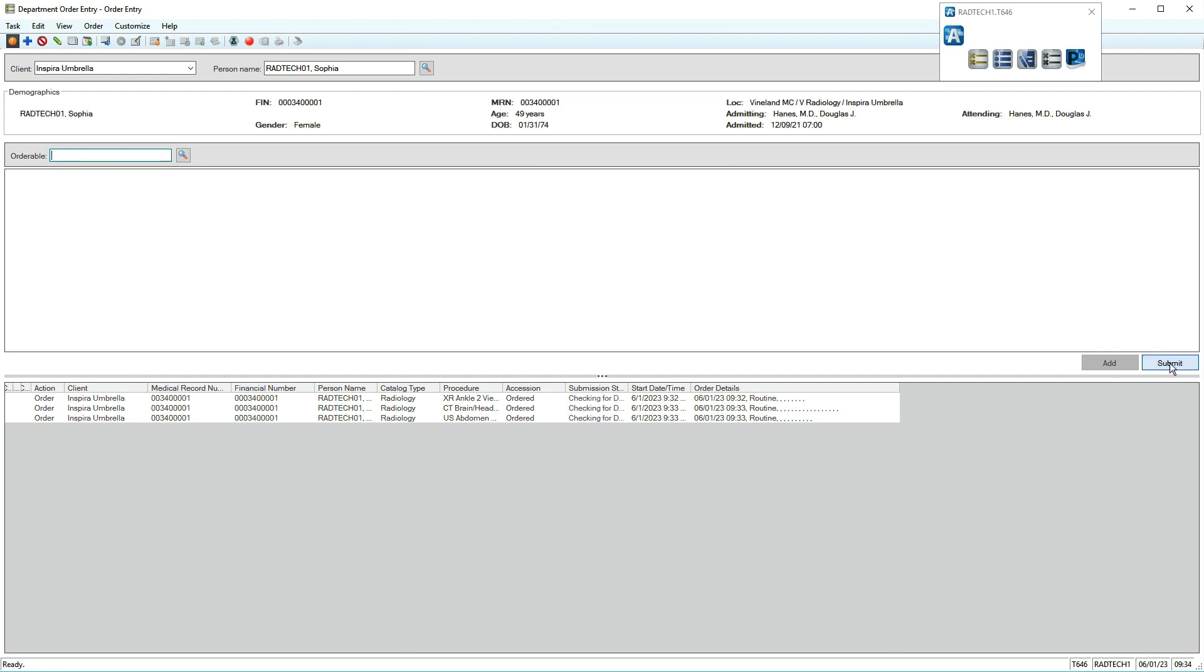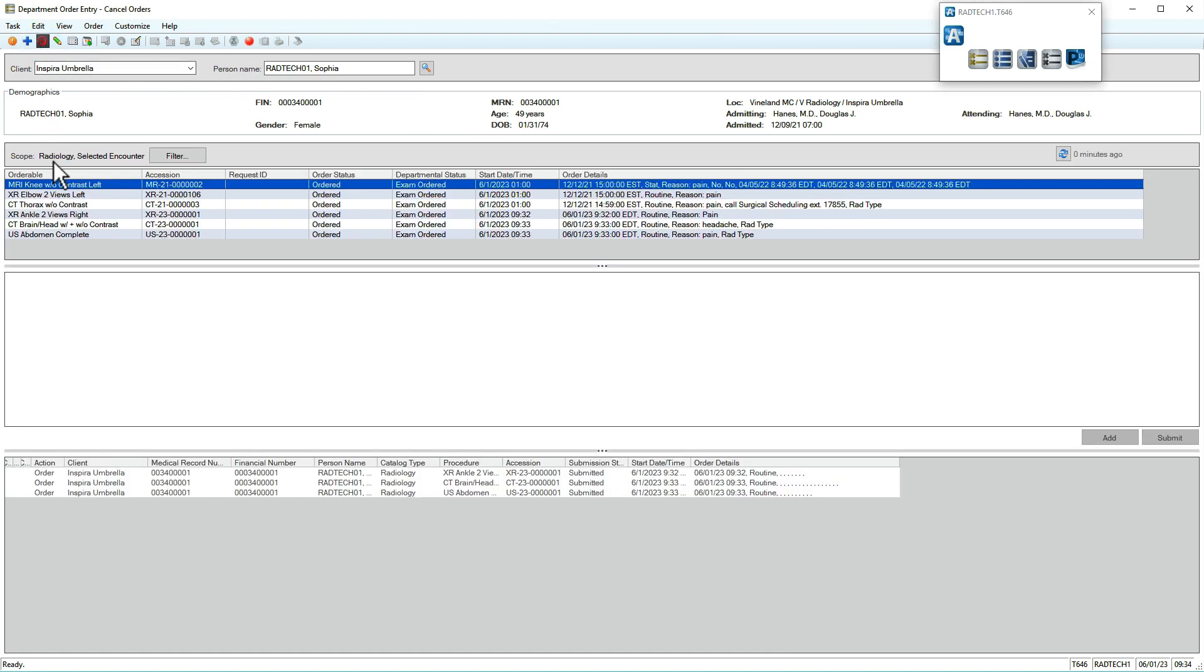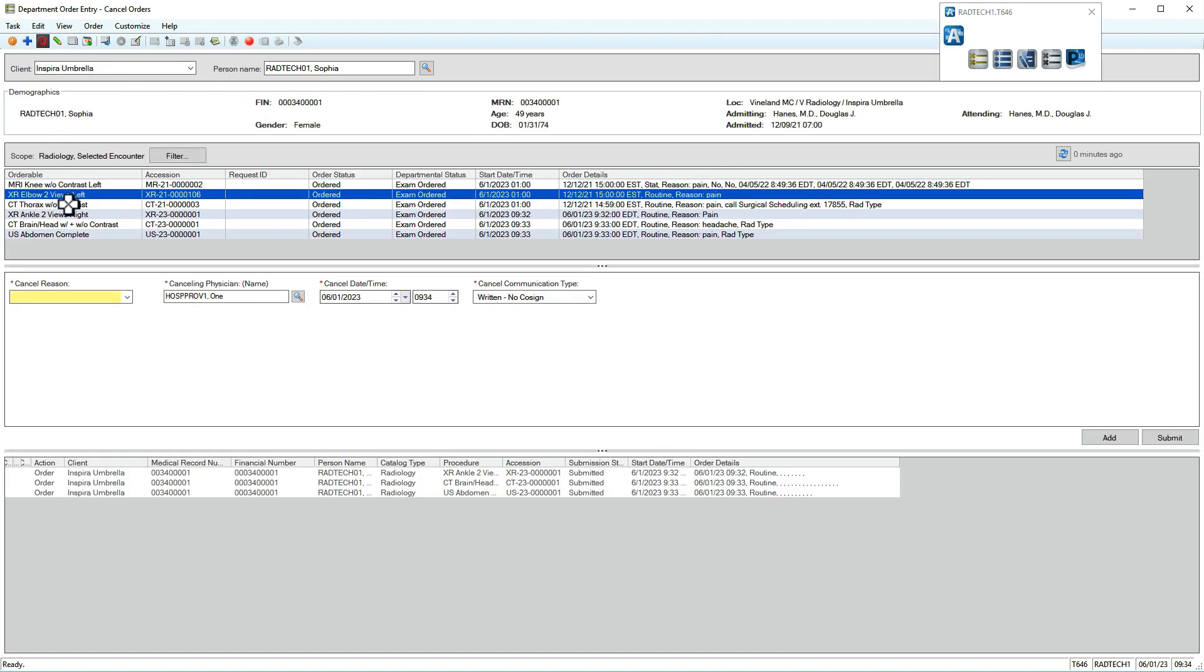To cancel orders, click the Cancel Order icon in the upper left. The patient's current orders display. Select an order, specify a reason, then click Submit.